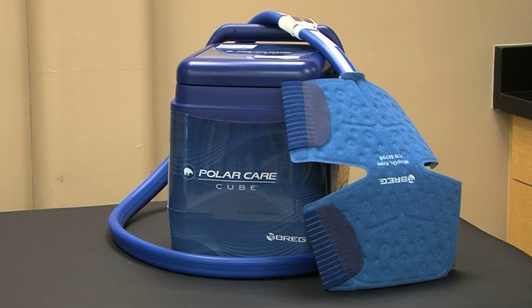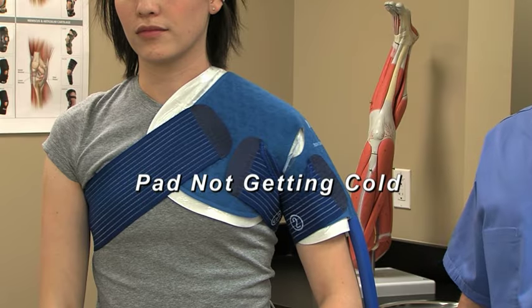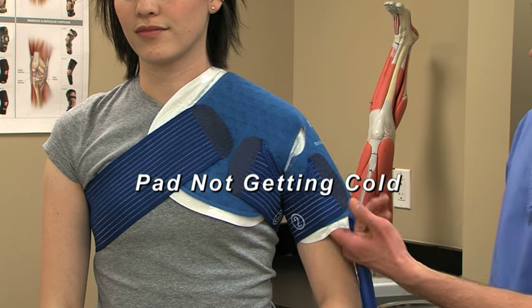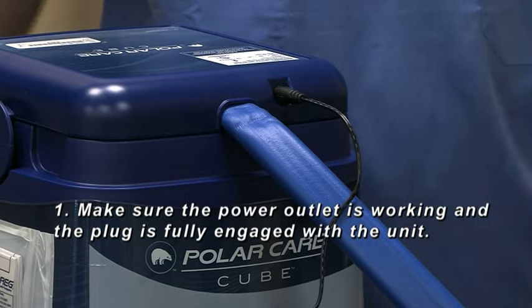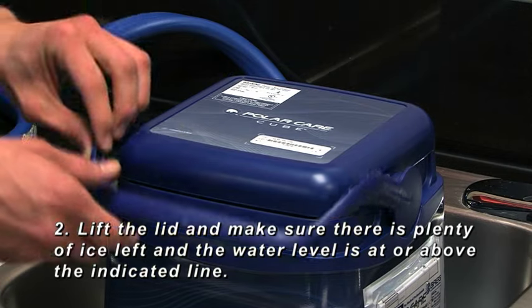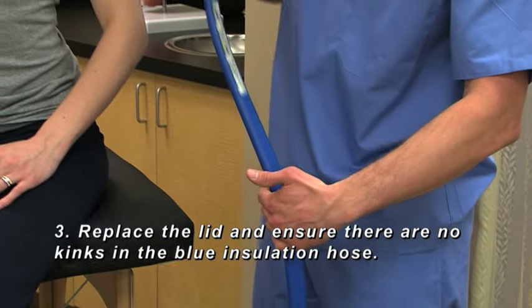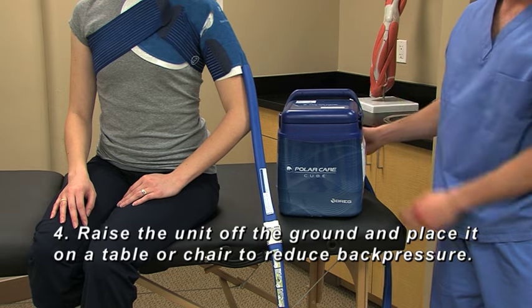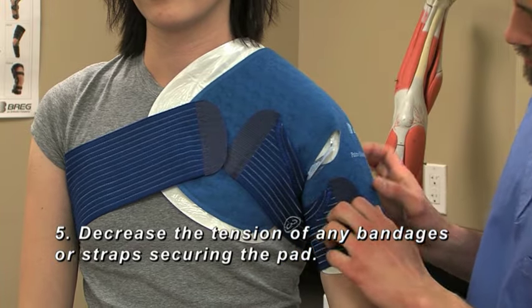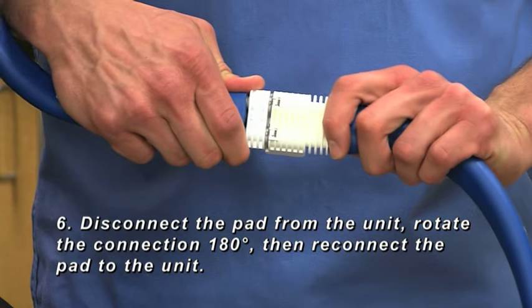Breg's PolarCare units are very reliable. With proper setup and maintenance, our customers experience very few difficulties. In the event you run into an issue, let's go over a few tips. If at any point the pad is not getting cold, take the following steps one at a time until the issue is resolved. One: make sure the power outlet is working and the plug is fully engaged with the unit. Two: lift the lid and make sure there's plenty of ice left and the water level is at or above the indicated line. Three: replace the lid and ensure there are no kinks in the blue insulation hose. Four: raise the unit off the ground and place it on a table or chair to reduce back pressure. Five: decrease the tension of any bandages or straps securing the pad. Six: disconnect the pad from the unit, rotate the connection 180 degrees, then reconnect the pad to the unit.